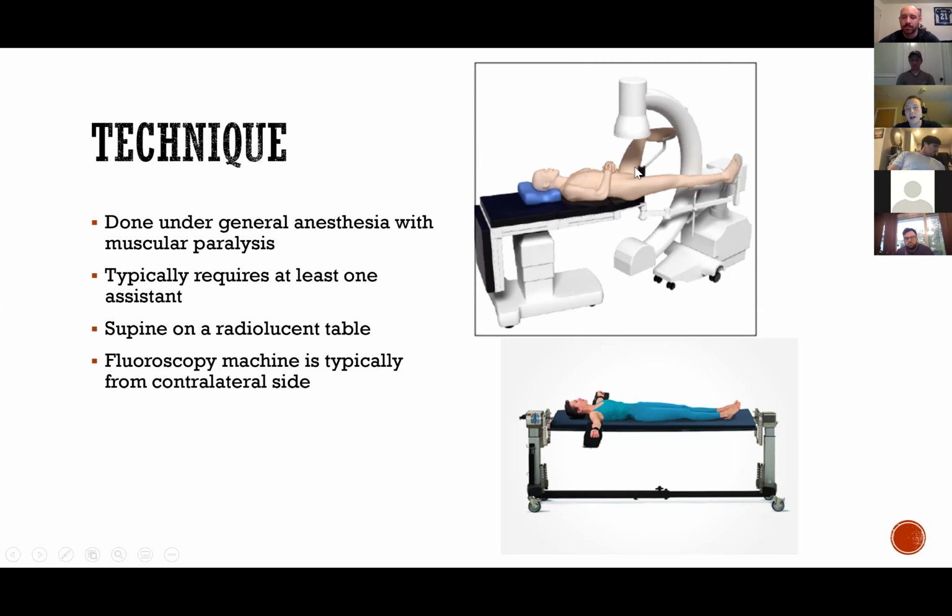For hip type fractures, these might be done on what we call a fracture table, where the patient is suspended with only support under the gluteus, and the legs are free floating in these holsters. And you put the well leg out of the way. You bring the C-arm in between the two legs in order to be able to image the injured leg. And this outrigger boom can apply traction to the injured leg, and you can change the rotation as well, so that you can work up here and instrument the femur.